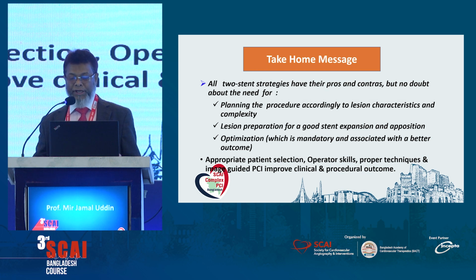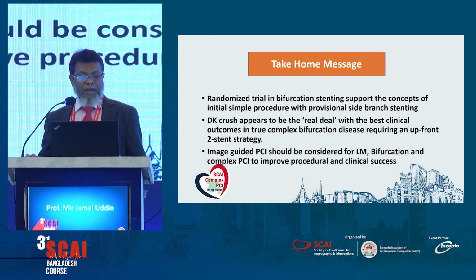Appropriate patient selection, operator skills, proper techniques, and image-guided PCI improve clinical and procedural outcome.